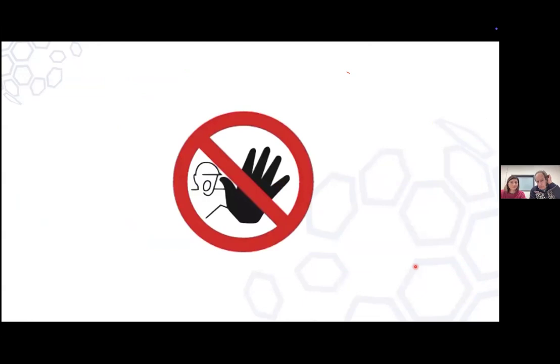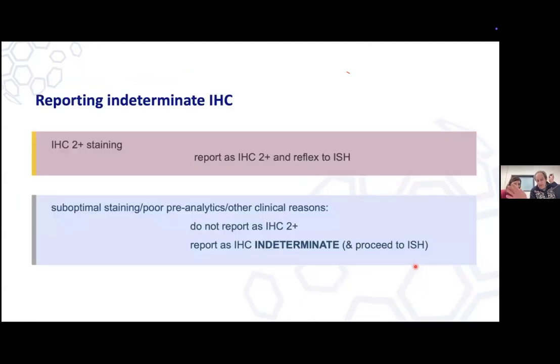So there is another caution. I can't remember what this caution is. This caution is exactly like, okay.